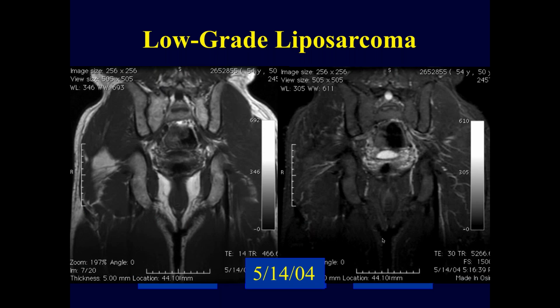And we're seeing a larger area of... And now, we had no T1 axial on this sequence. And we had no T1 coronal in the previous one. So, I'm trying to make a point here. If we had T1 axial here, that area we were talking about in the prior one would look larger, especially there. Because that's pretty big, and it didn't look that asymmetric, which, if you go back to the original one, we didn't really see.